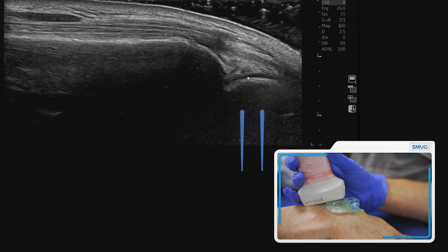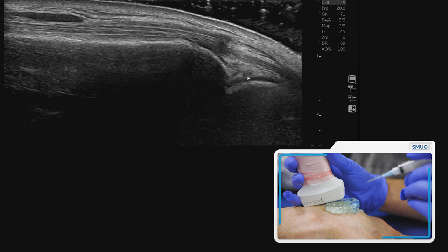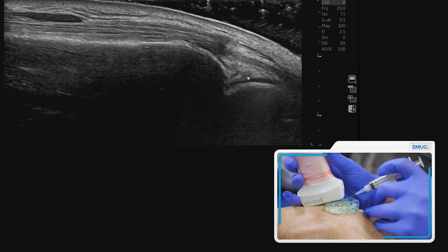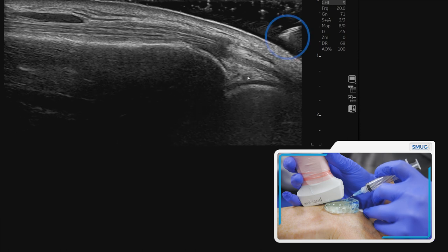You can see the articular cartilage. With sterile gel, you can actually put the needle in and you can see the needle and the needle tip in the gel.